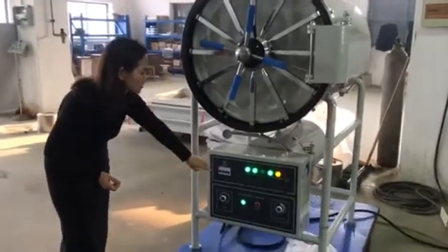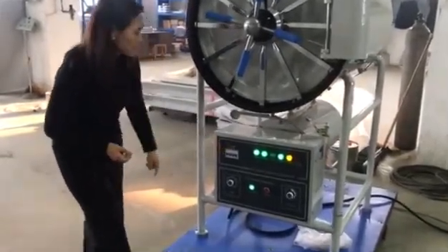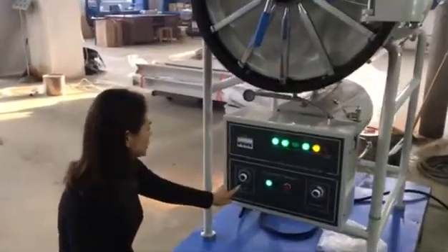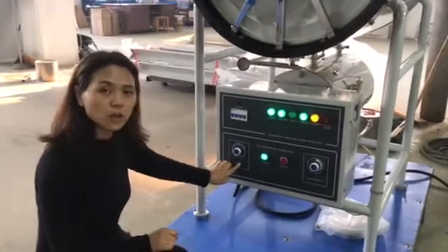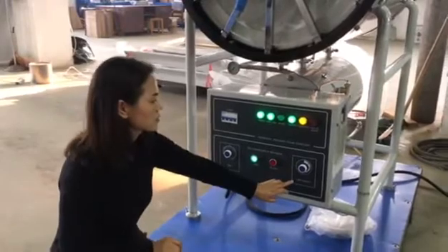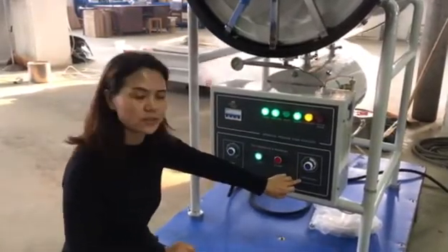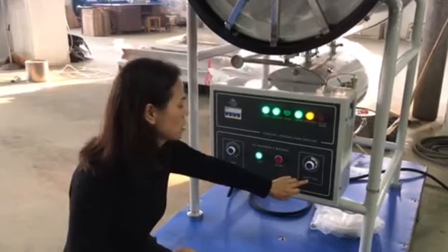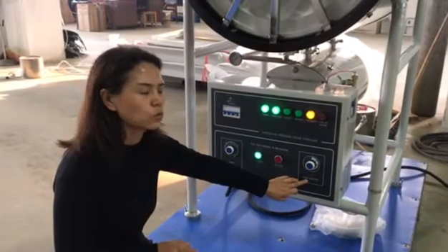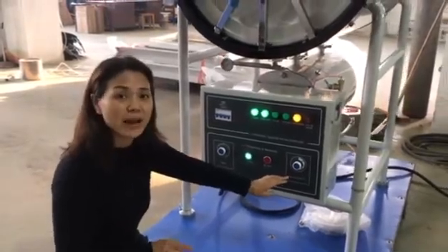The second step is open the power button. After opening the power button, the third step is set up the timer. Normally we set up the timer for 30 minutes. Then the fourth step is set up the temperature. The temperature normally is around 132 — normally we set it at 132.